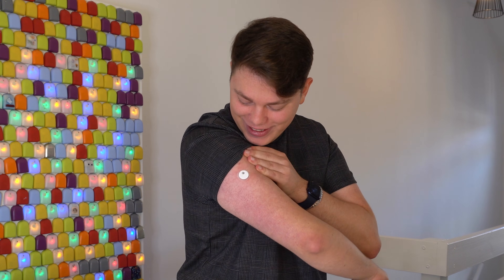Freestyle Libre 3 integration is a huge deal. This will be the first hybrid closed-loop system to work with a Libre CGM. Quick reality check though — we have been down this road before. Abbott signed insulin pump partnership deals years ago with Tandem to integrate Libre CGM into Tandem's Control IQ system, and with Insulet to integrate Libre with Insulet's Omnipod system. Both of those haven't materialized into any physical product, still working on those partnerships years later. So it remains very unclear when Libre 3 will be integrated into the My Life Loop system.